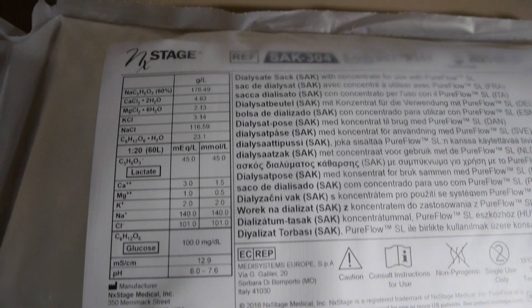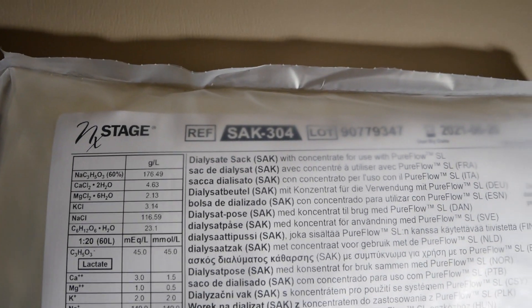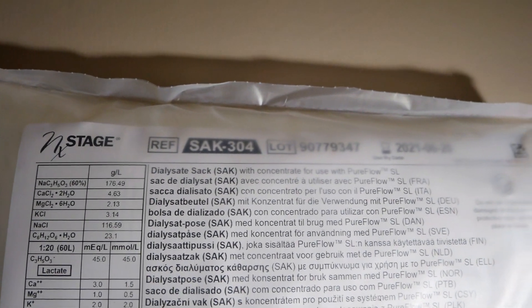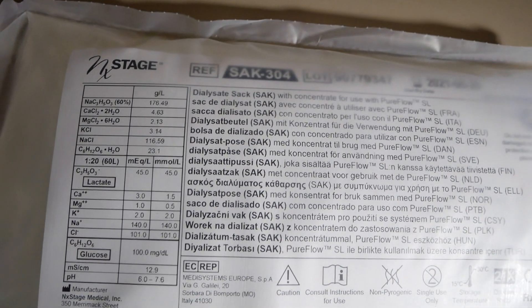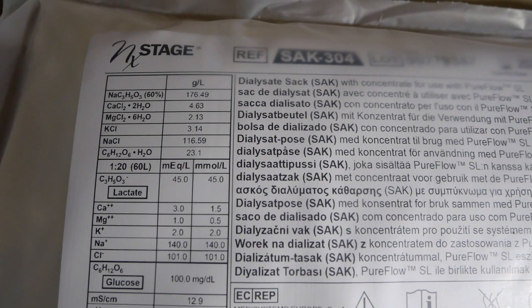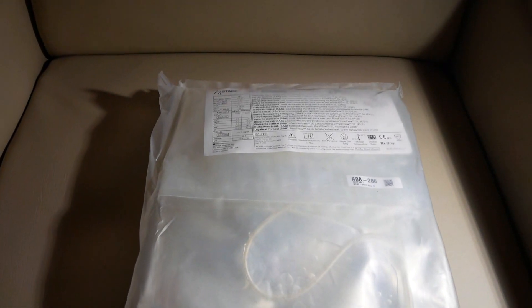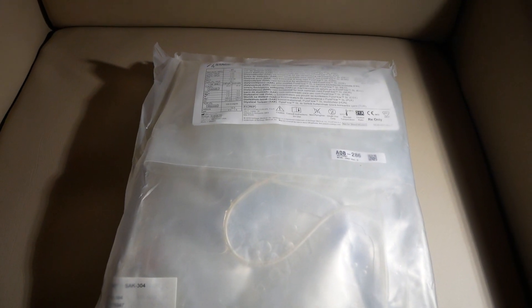This video shows how to load a sack in order to make a batch. At the top it says sack 304 - that's the particular prescription number. Underneath it lists all the things that go into that prescription, item by item, and how much of it is in there.